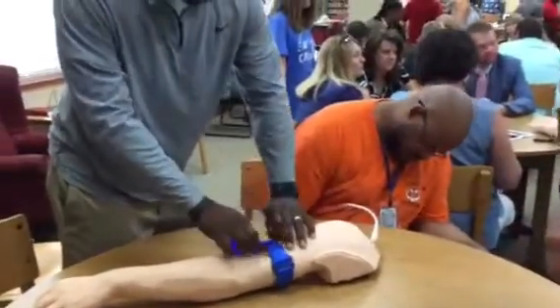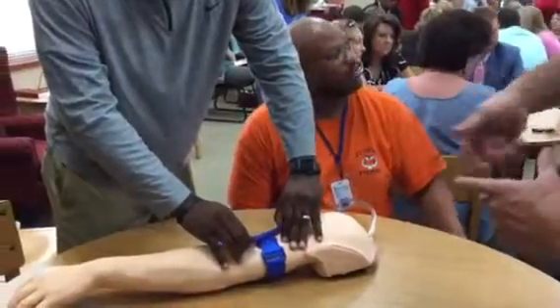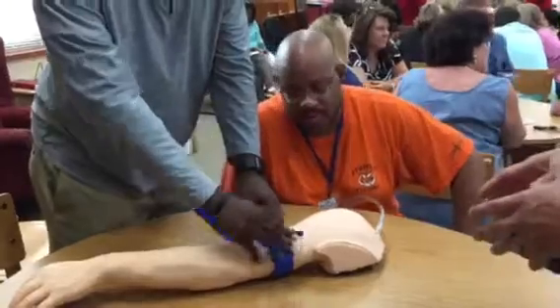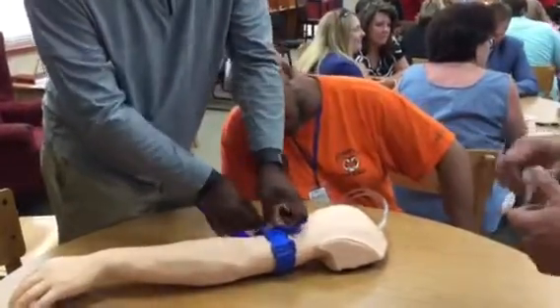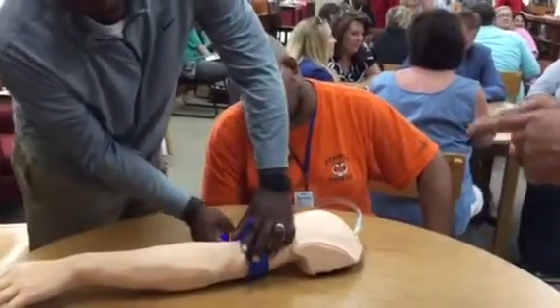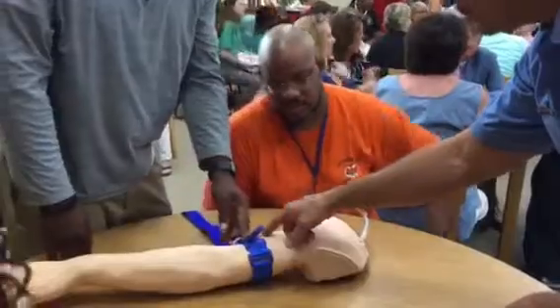Is it supposed to twist up like this? Yes. When I did it up here I just twisted it a couple times, but you may have to go four, five, six times around. You're watching for the blood to stop. You're going to have to keep twisting it until you're confident that the bleeding has stopped, which is going to be a lot. Then you lock it in just like this.